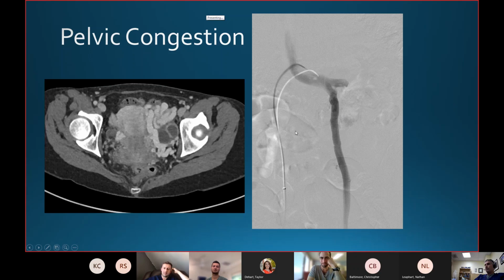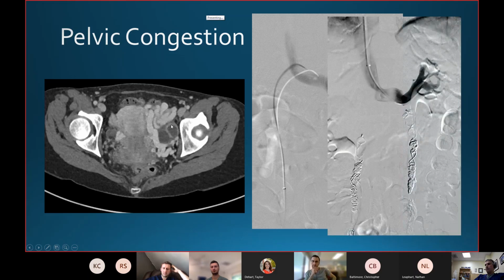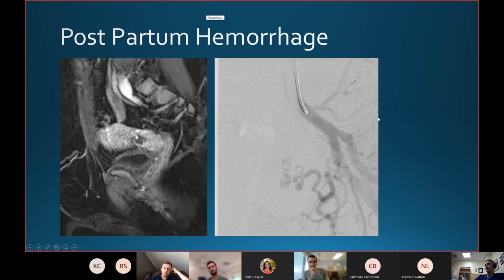So what that causes is when a woman is standing up and walking around, gravity's pulling this blood in the pelvis and causing pain. So what we do in these cases, we sclerose these veins down here. I didn't show that because I don't have time, but on their way out, we coil these veins. We use pushable coils here, and then at the top, we can put little plugs to get really well controlled, and now we stop the reflux. Okay, it's a controversial treatment because it doesn't work in everybody, and the gynecologists think we're crazy for doing it.